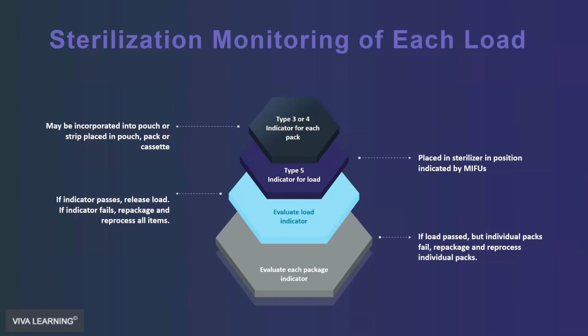And we explain to the patients, this is an extra thing we do in all of our instrument packs to make sure that they're safe for use. This one, we noticed, isn't. So we're going to get another one. And they bring another cassette in, they unwrap it, they check and show this one has passed. And so in this particular instance, the patient wanted those indicators. They wanted to take them with them, and they took them back to work and they showed them to their coworkers. This is what my dentist does to make sure the instruments have been sterilized.